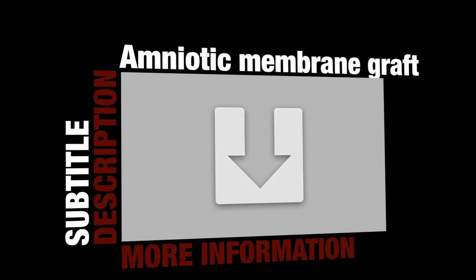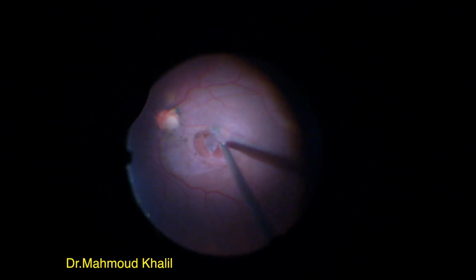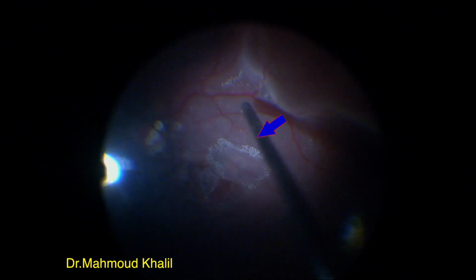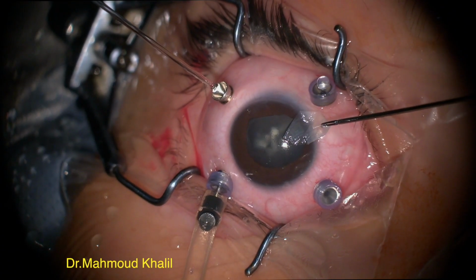Another technique is doing amniotic membrane graft. This patient was previously operated and the retinal graft was done, but unfortunately the retinal graft was displaced, partially covering the macular hole. This was a very large macular hole, about 2 disc diameters. Part of the graft is covering and part is outside, so I decided to do amniotic membrane grafting.